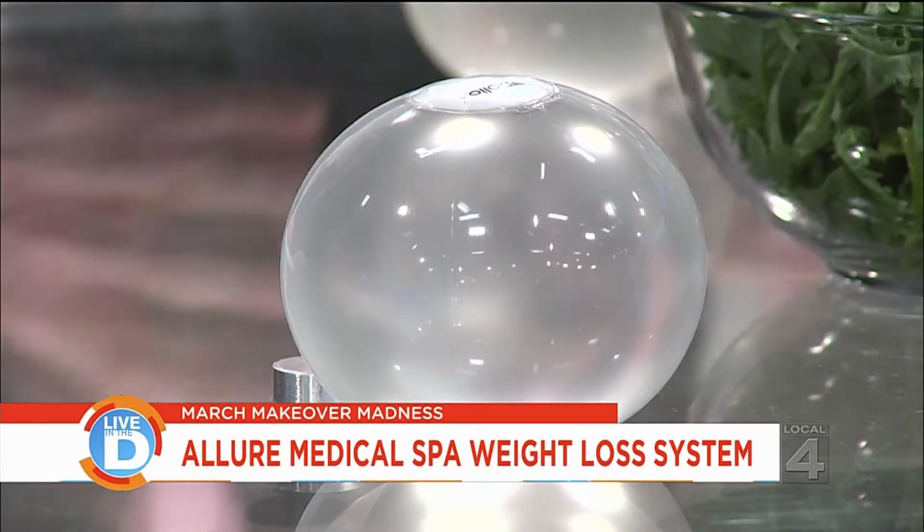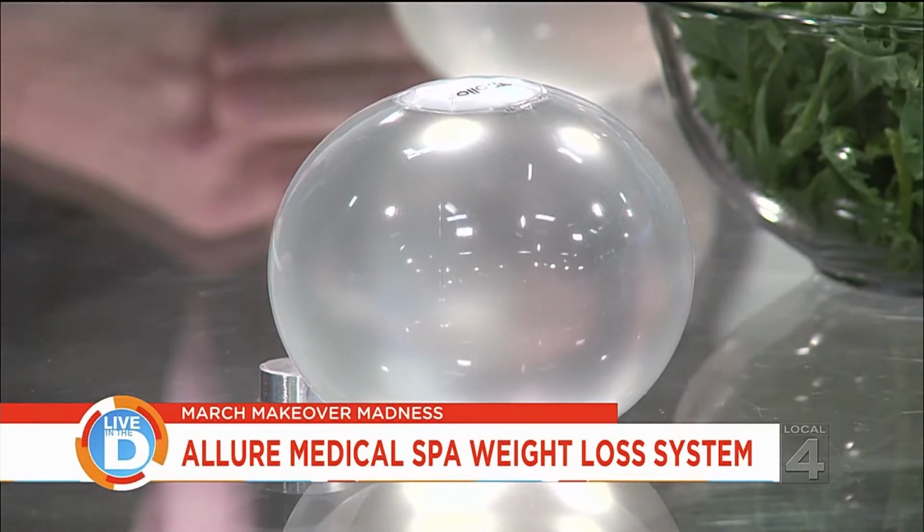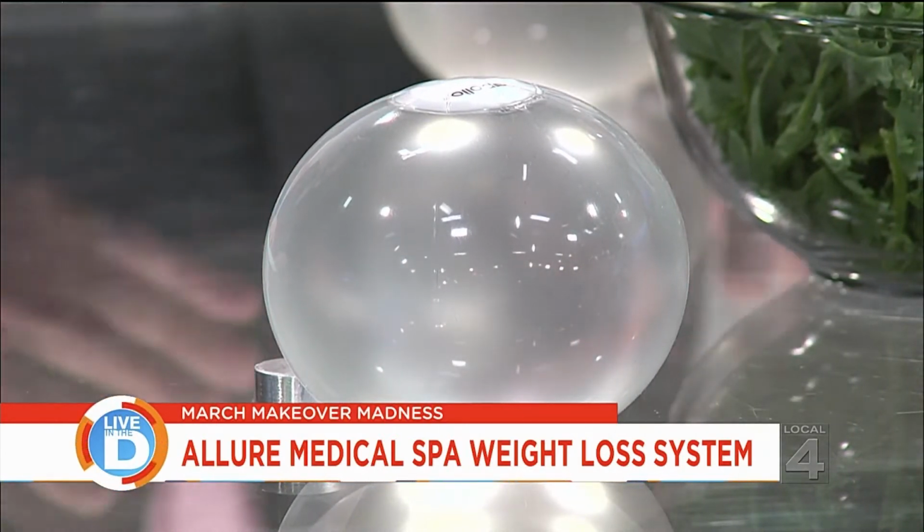Basically, it's a device that we place endoscopically. So it's a sedation procedure, as if you're having your colonoscopy or an upper endoscopy or even just a minor procedure. So we provide sedation, and then while the patient is sedated, we do an endoscope. We look down into the patient's stomach, and we look around, make sure everything's safe for placement. Make sure the coast is clear. Exactly. Yes, absolutely.